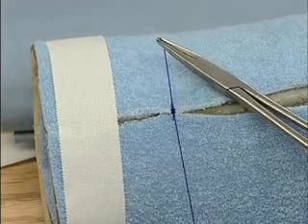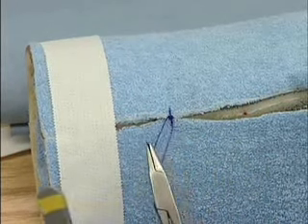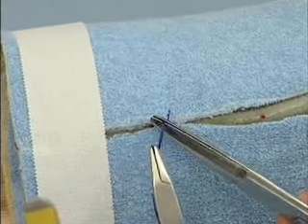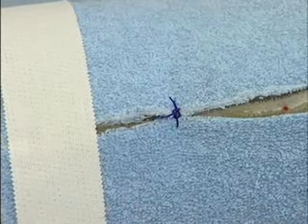Now you'll notice on that suture that the initial knot didn't tighten, so on the next knot we'll perform a surgeon's knot.